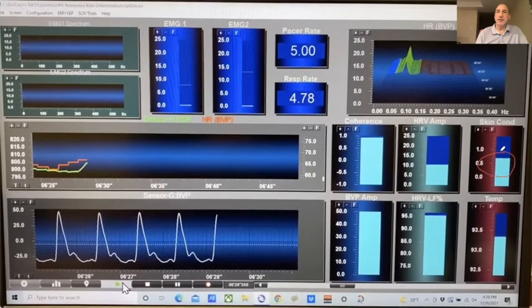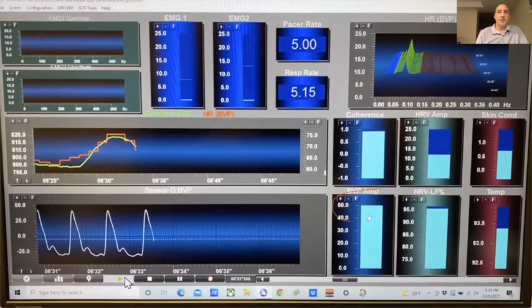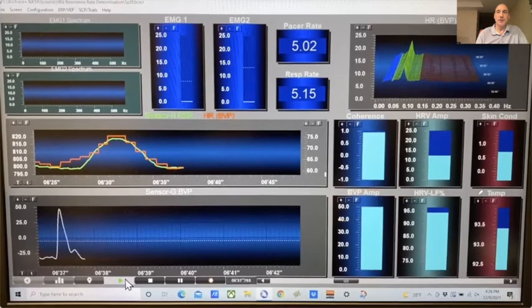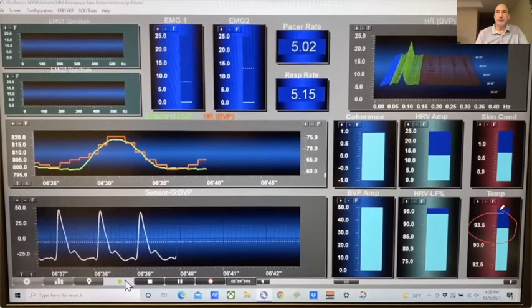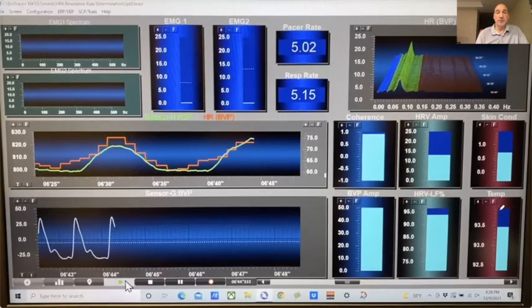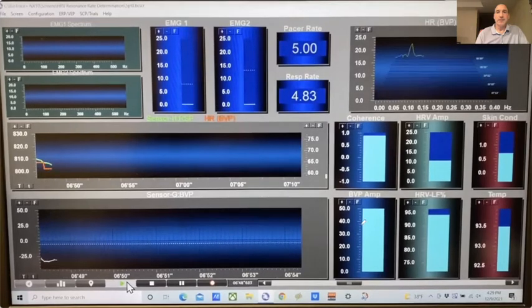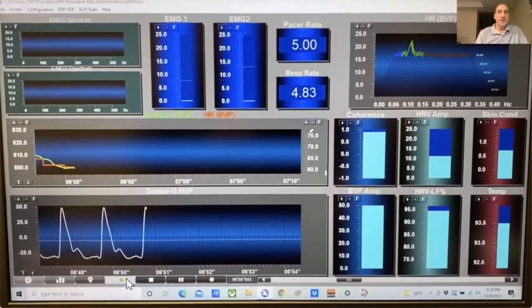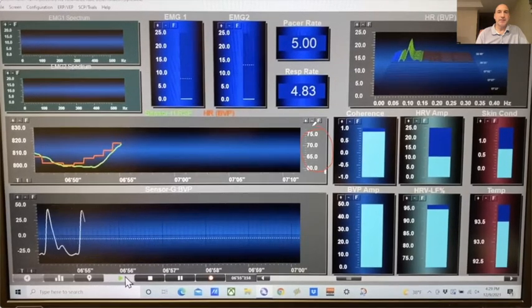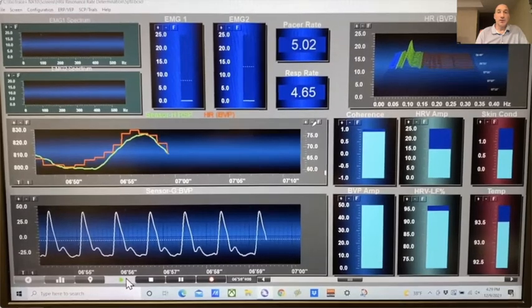Their skin conductance here, just a little under 1, which is great. Blood volume pulse up around 50, so they've got good peripheral blood flow. And here, peripheral temperature at about 93 degrees, which is, again, great. So all of this is moving along nicely. We notice that their heart rate is fairly low. They're moving between a range of 60 and 75 beats per minute. So the system is doing well.